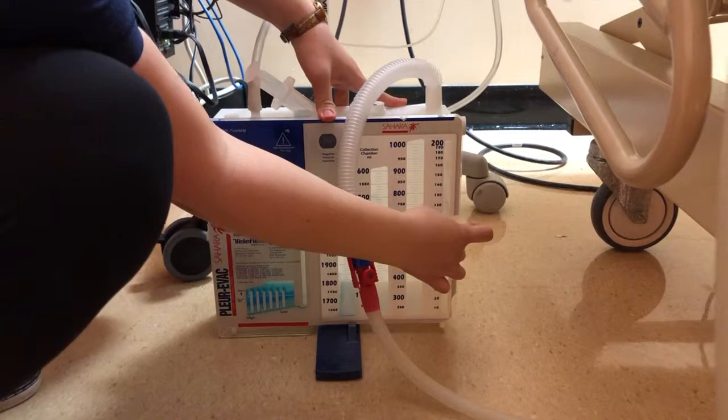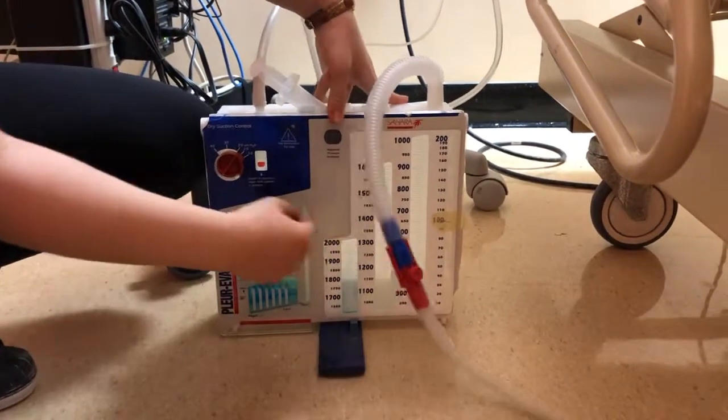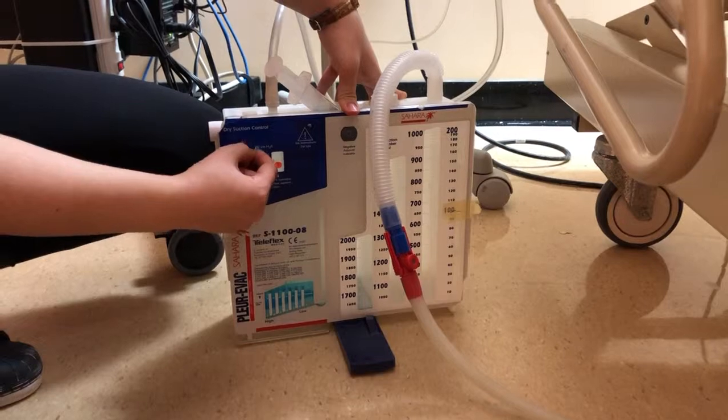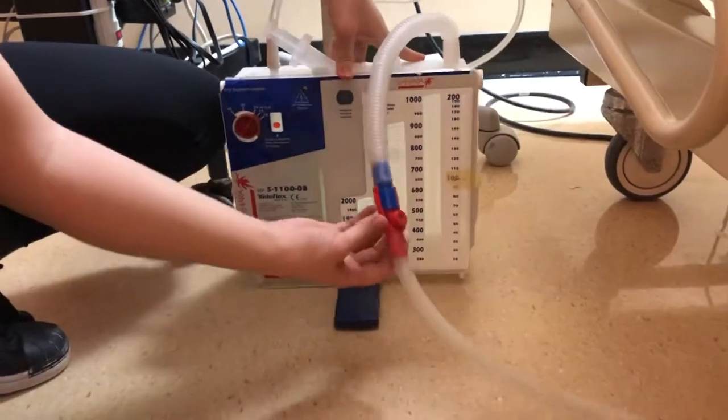At the start of the shift, I'm going to check the drainage amount, and the orange ball is here, and the H2O remains at 20 centimeters as per order.